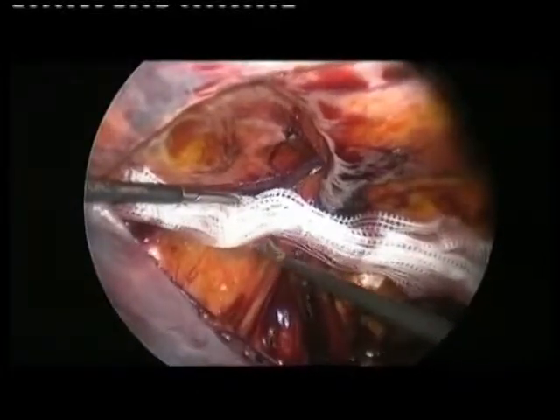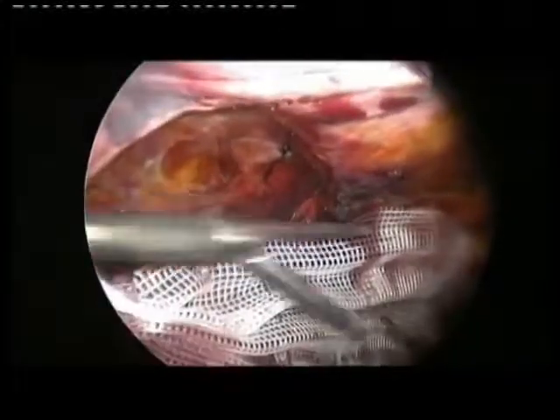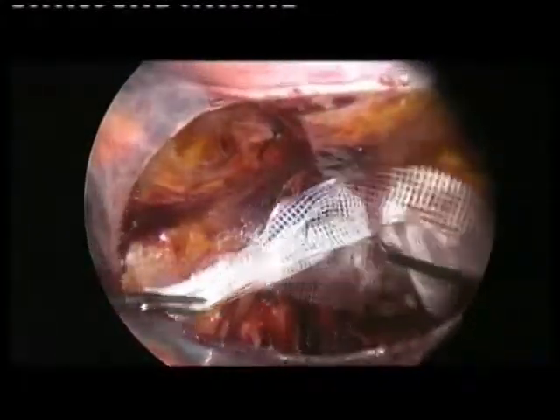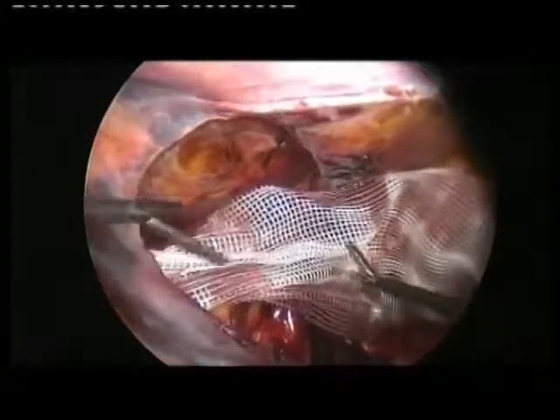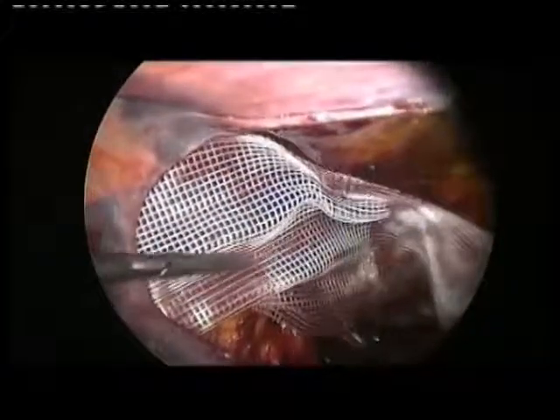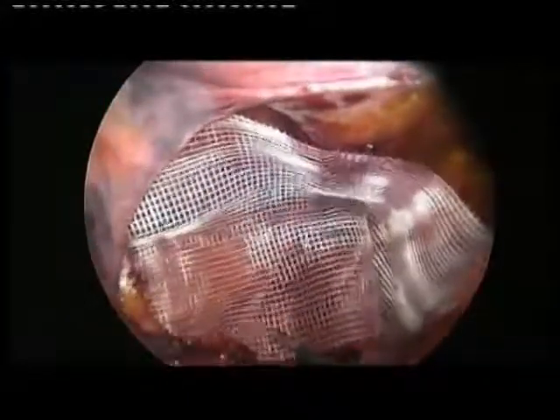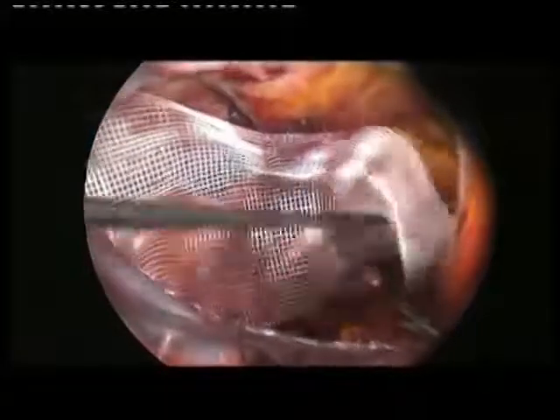So now we start to open the mesh, and then just a second, don't pull. Okay, go. Okay. That's okay. The mesh is positioned. Okay.